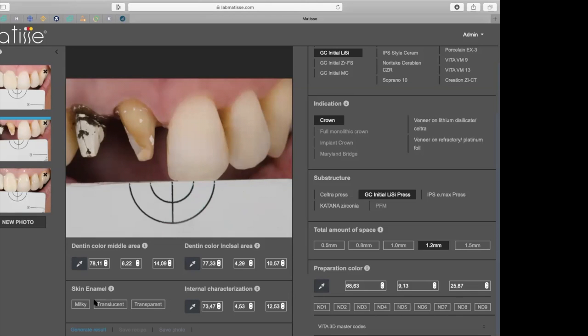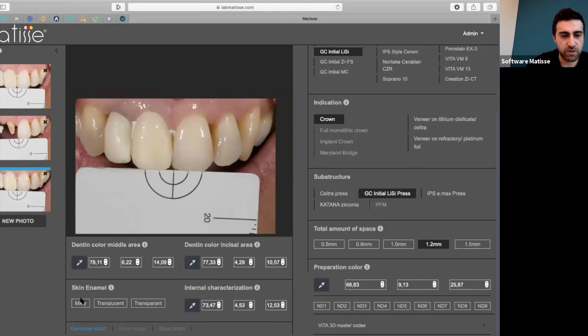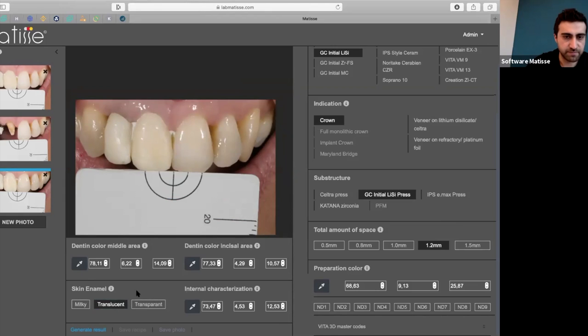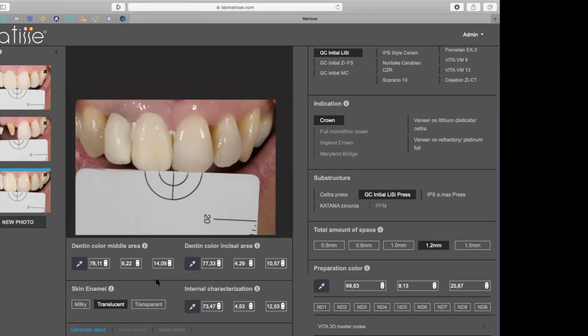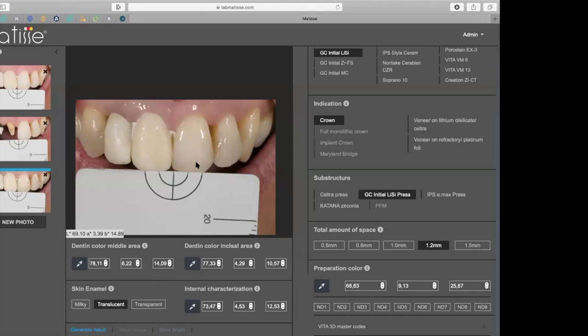And we have to choose the enamel. So it's not milky, because the tooth is not white, right? It is translucent. Most of the cases that you will do will be translucent. If, for example, you choose translucent and the incisal area is more transparent, you can mix the enamel advice that Matisse gives with a more transparent material.